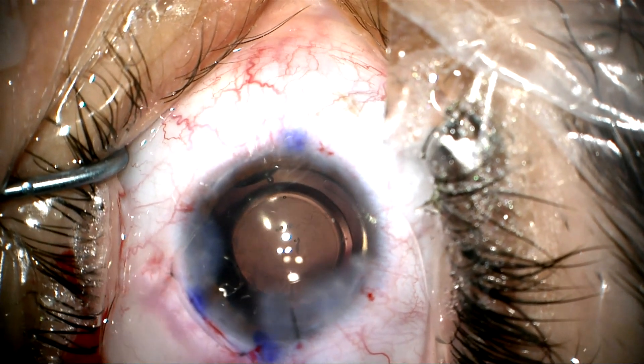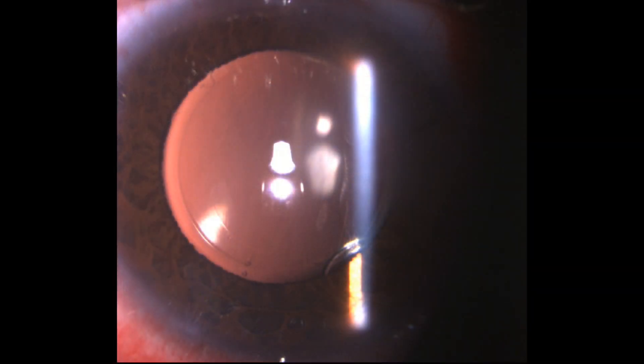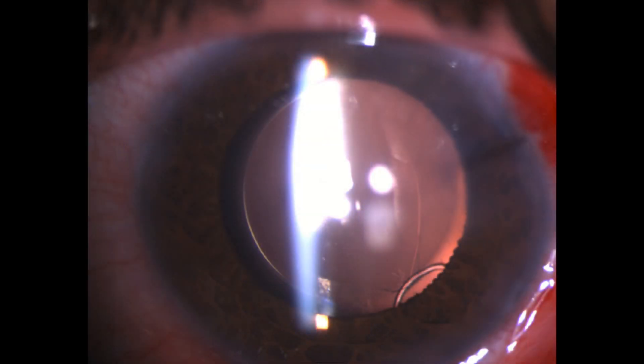The next day in the office, the lens looks very well centered. The patient saw 20/40 with a correction of minus 0.5. Thank you for your attention.